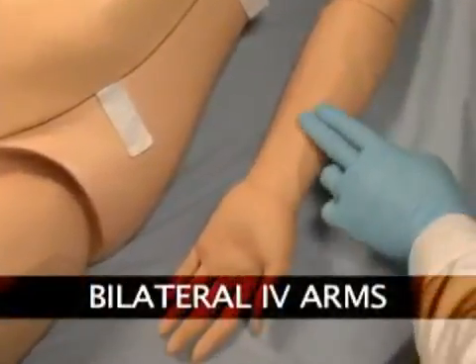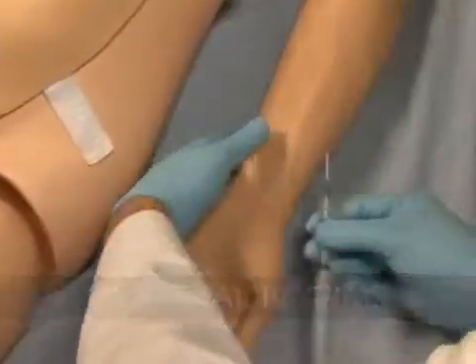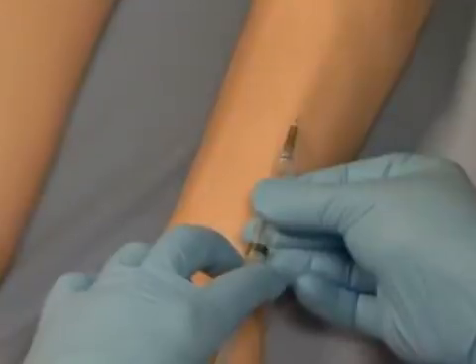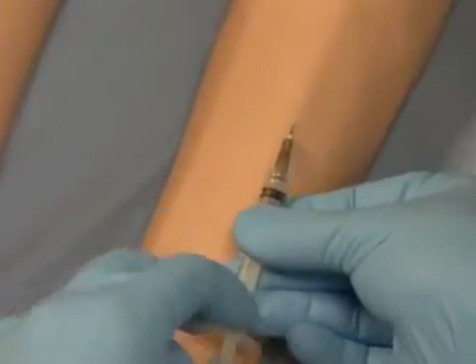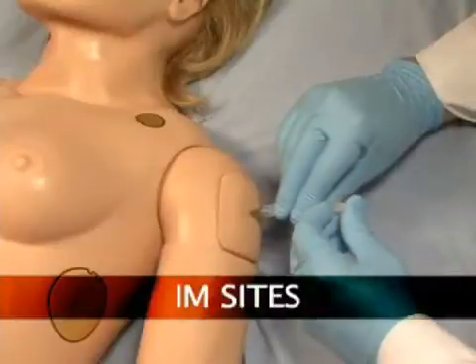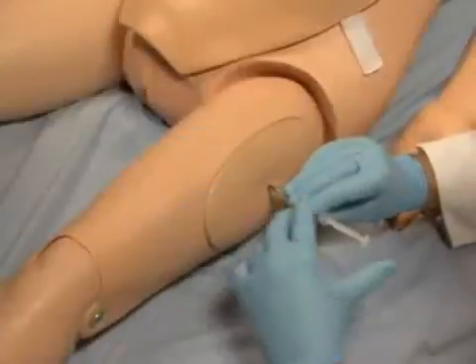NOEL has bilateral IV training arms that can be used for bolus or intravenous infusions, as well as for drawing fluids. In addition, she has IM sites on both her deltoids and quadriceps.